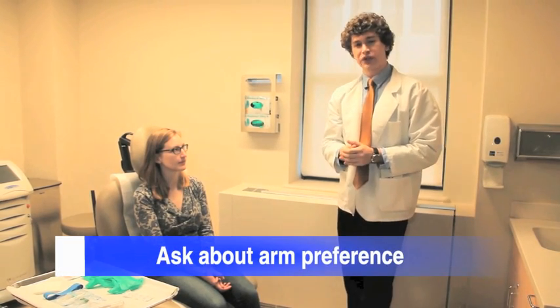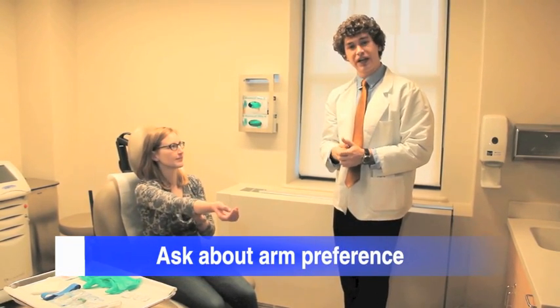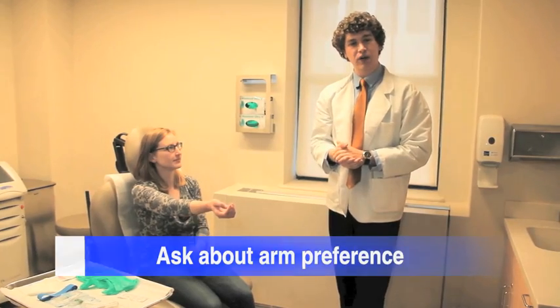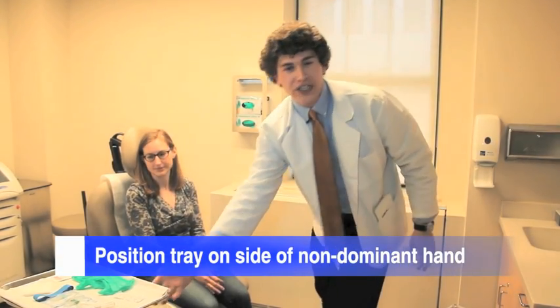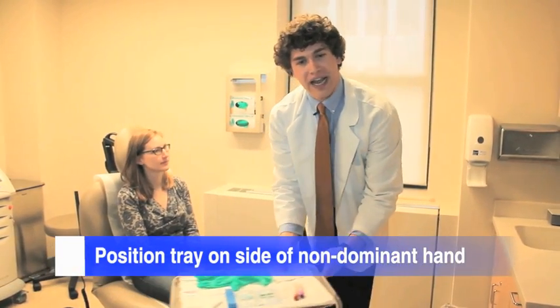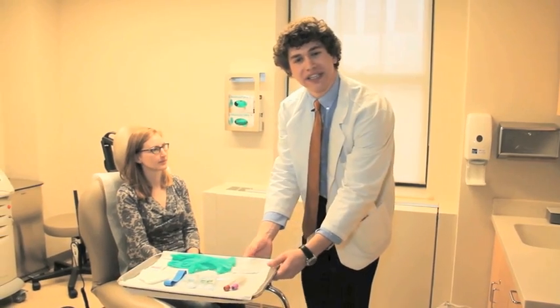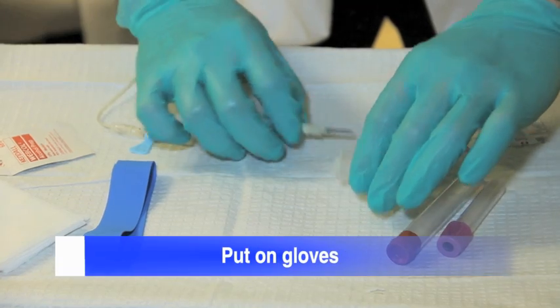Ask the patient whether they have a preference for an arm from which to draw blood and position the standing tray accordingly. The tray should be on the side of your non-dominant hand and all materials should be easy to reach. The medical student drawing blood in this video is right-handed, so he has correctly positioned the tray to his left and all materials are comfortably within reach.